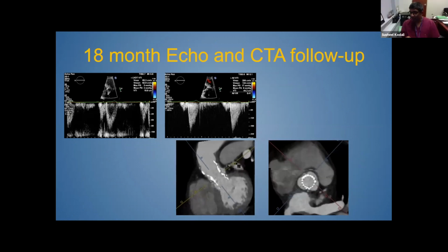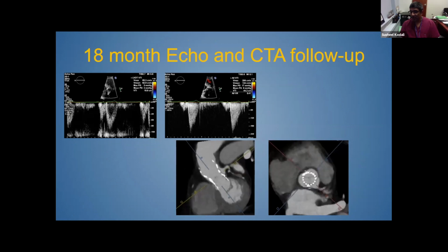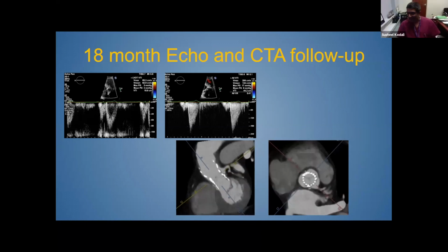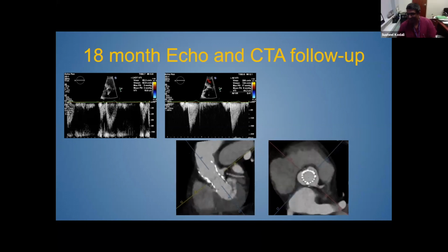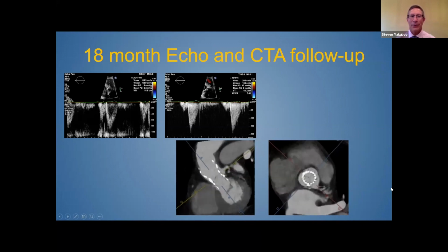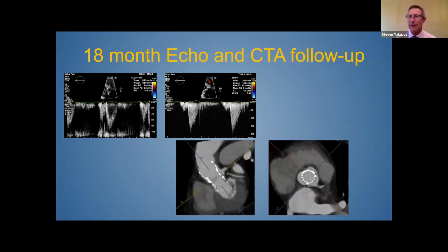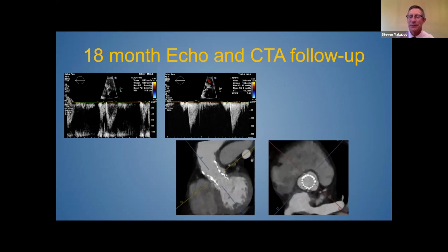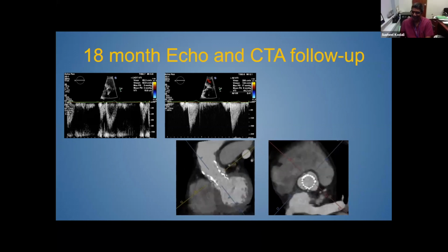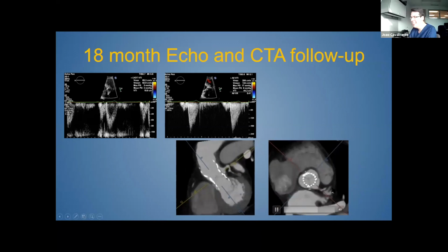The other thing I want to point out, this image is beautiful. You did perfect commissural alignment with your CoreValve. I am impressed. You've got to teach me how you did it, because I try that, I never get it. Yeah, I do give anticoagulation for 3 months. I don't know why 3 months. We may have picked it out of thin air, but that's what we do. Yeah, so you picked up on the image because I aligned precisely on the left main there. Yeah, that's exactly the point I was going to make. I'm impressed. Nice.